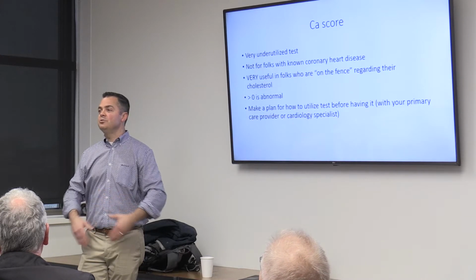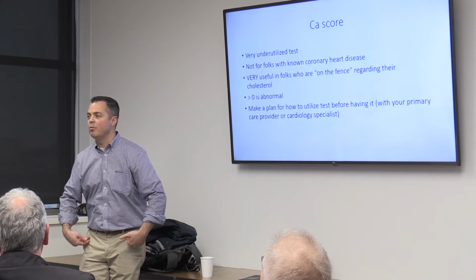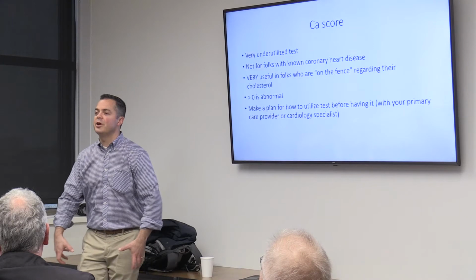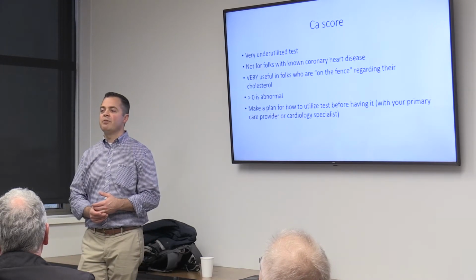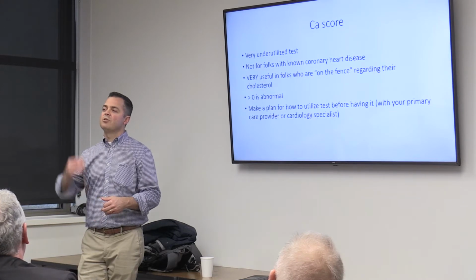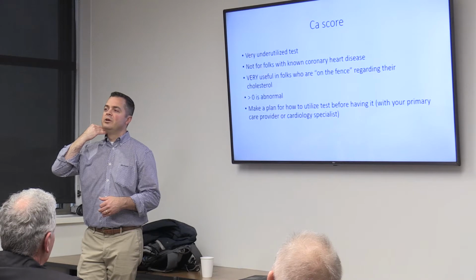Now they do give you ABI images. ABIs are ankle brachial indices. Those are tests of your legs to look for blockage. They'll show the pressure measurements of your legs, which can be helpful. But if I want to look at the image of your carotid arteries, they'll do what's called a 2D or B-mode ultrasound of your carotid artery.